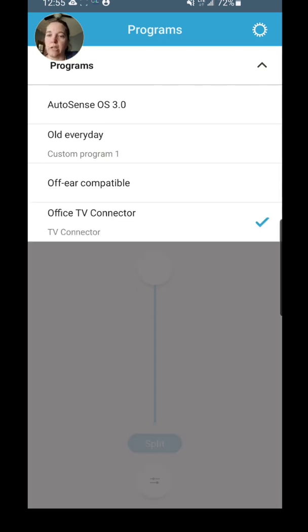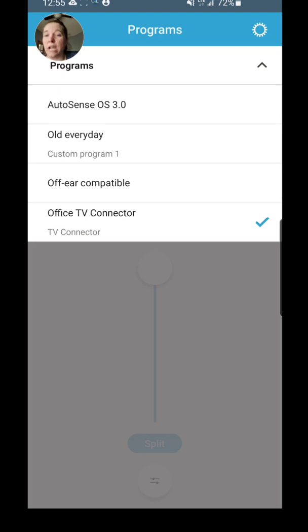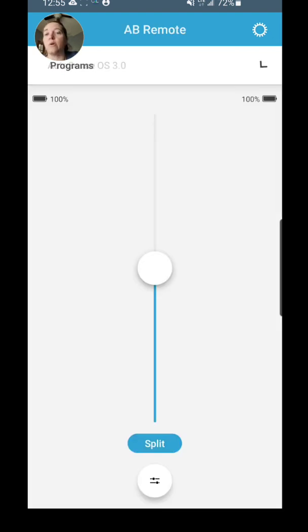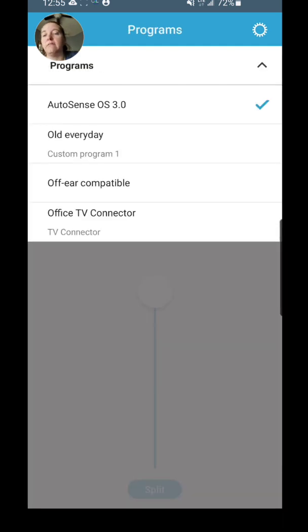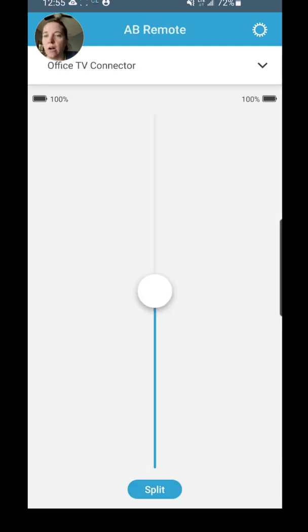There you go. So now I have my Office TV Connector—it's connected here. This allows me to decide, okay, I don't want to listen to what's coming through my TV Connector right now, so I want to go back to AutoSense. You can tap on that, but let's say I want to stay on my TV Connector.